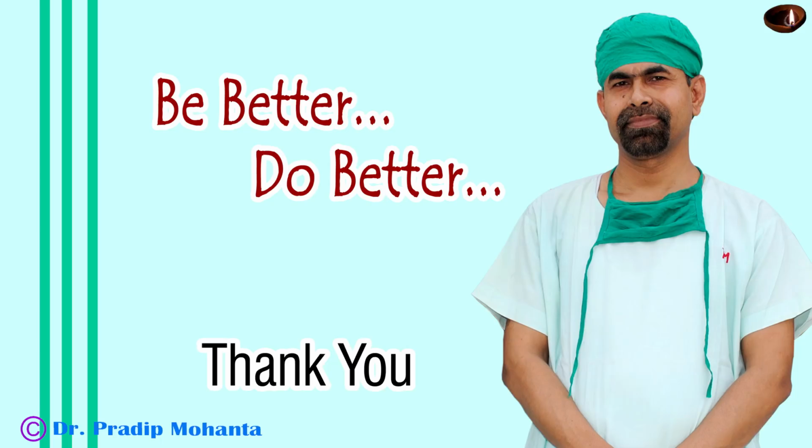Hope this video will help you in converting a small rent into a posterior CCC, and in some cases you can manage PCR without vitrectomy in this technique.